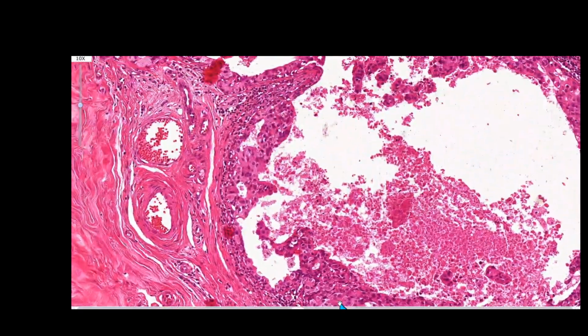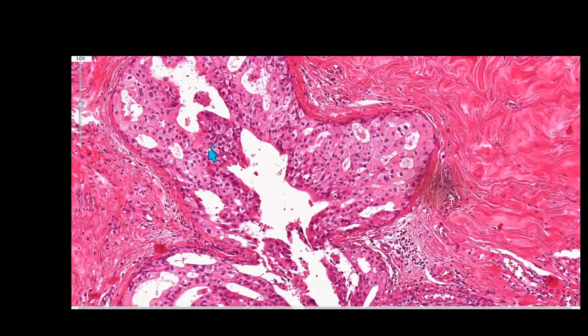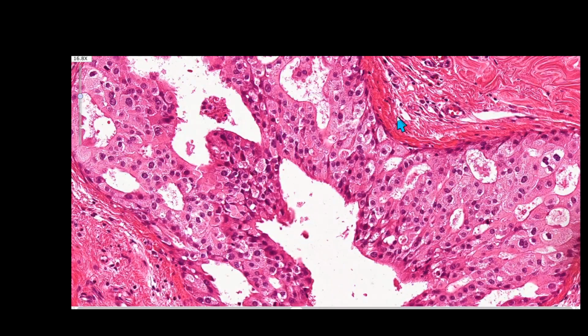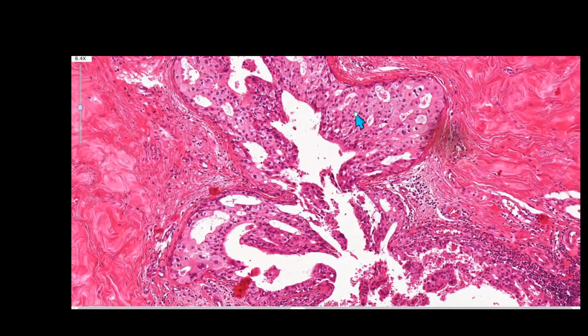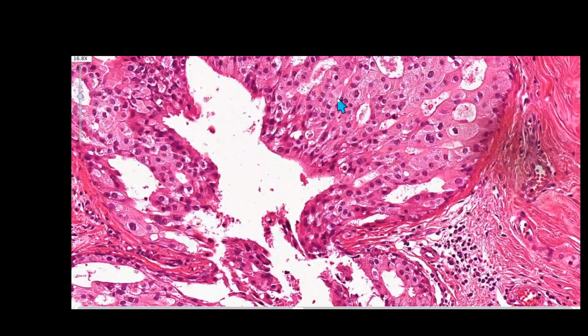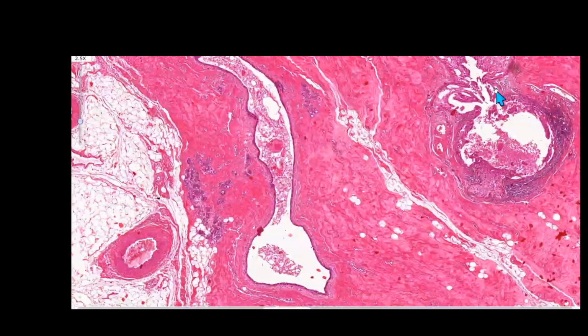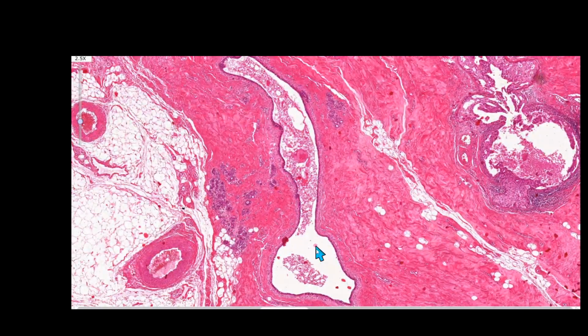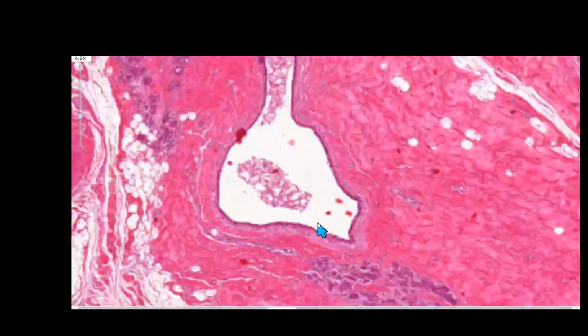But if we look at this part, here is a huge breach again, through which these cancer cells oozed out. This is neoduct genesis. They don't have associated terminal ductal lobular units. They are contorted. They are distended by grade 2 and often grade 3 cancer cells. Right beside it, there is a longitudinal section of a duct-like structure, certainly not normal. Ducts are normally simple tubes.